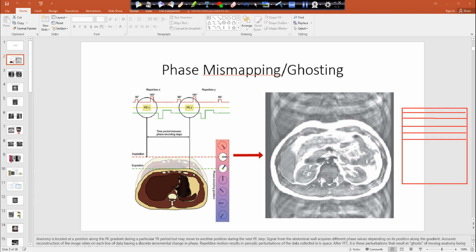So imagine we select a shallow phase encoding gradient to start. So one of these that are closer, we don't need to apply as much amplitude to that particular phase encoding gradient.